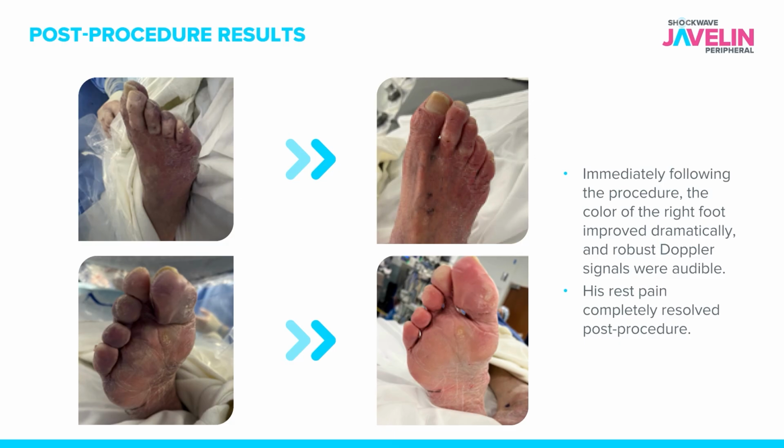And compared to pre-treatment, where we had diffuse discoloration of his foot and severe ischemia, immediately post-procedure, his foot pinked up, appeared to be much more well perfused than when we started, and he had robust Doppler signals that were very easily audible in his foot. In the recovery room, he had complete resolution of his rest pain, which is a very, very nice clinical result once again.